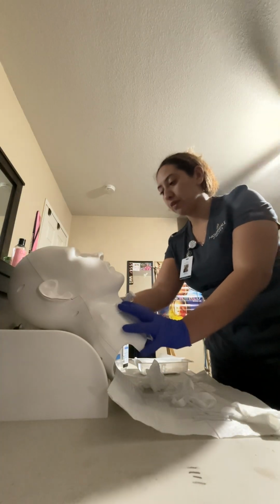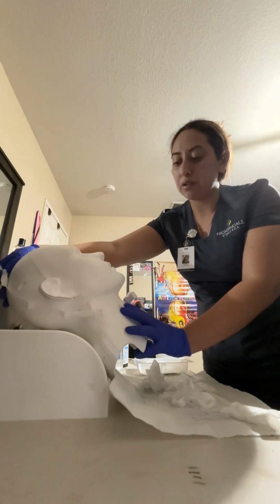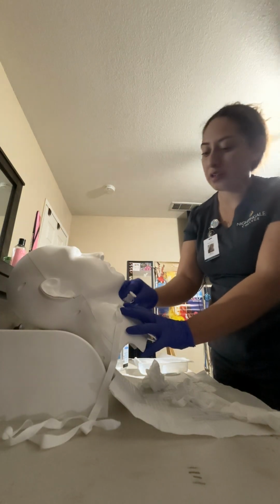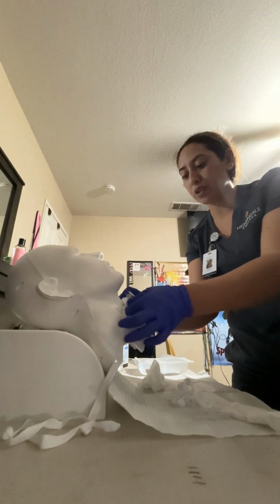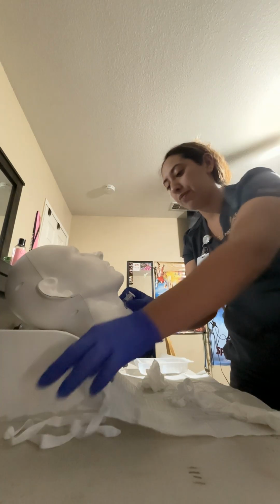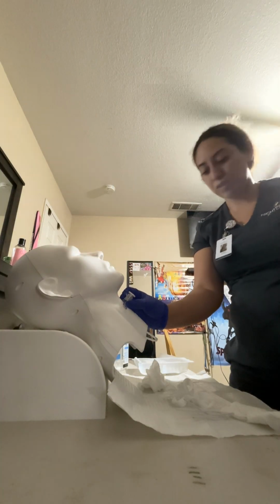So patient will lift his head slightly so that way I can pull it out on the side. Okay. So we will apply pressure here and just assure that this does not become dislodged. Okay. Now we will put the old trach ties into the trash.